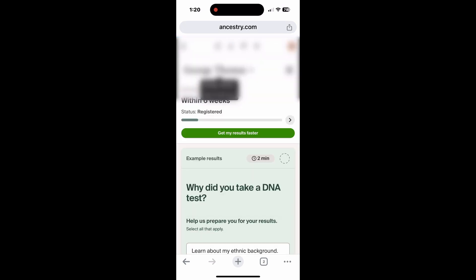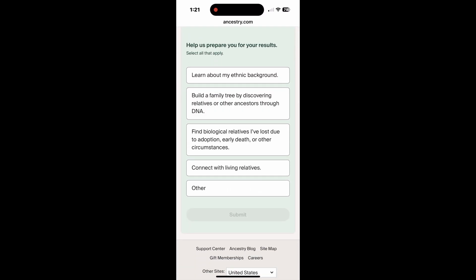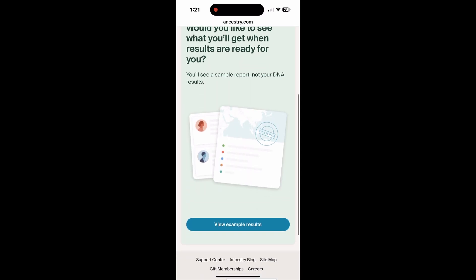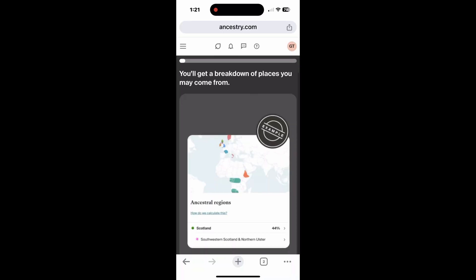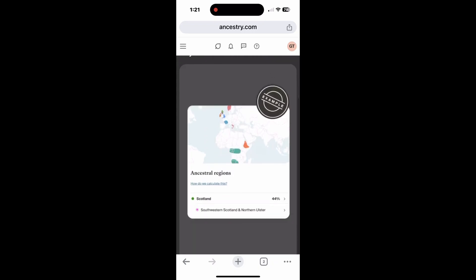Then there are questions about why you took the DNA test, with the following options: learn about my background, build a family tree, find biological family members, etc. And then we can take a look at some example results. Once we have our results back, this is what it'll look like — it'll identify your ancestral regions, provide a breakdown, and a lot of information.